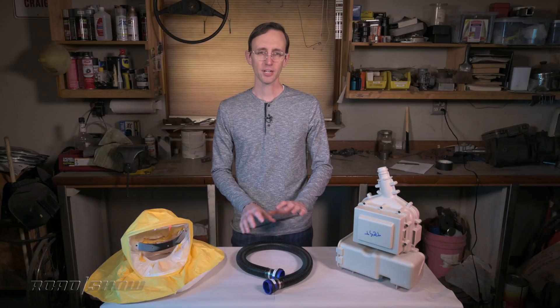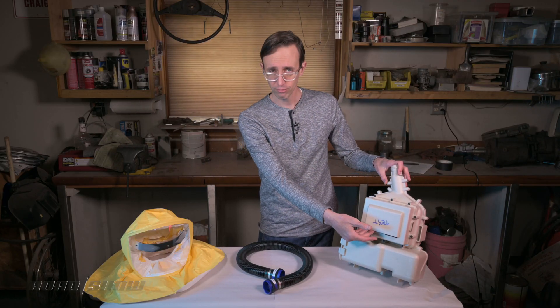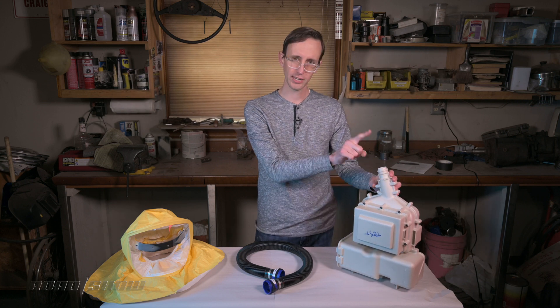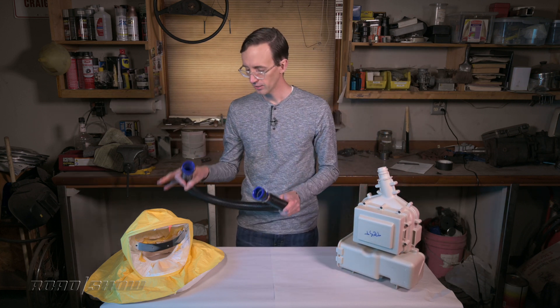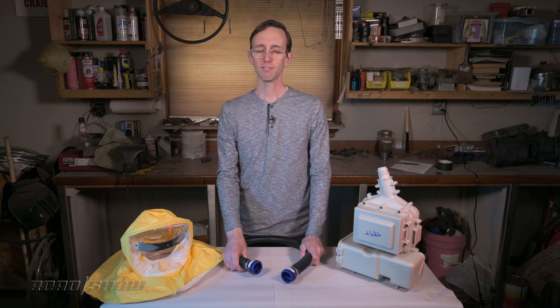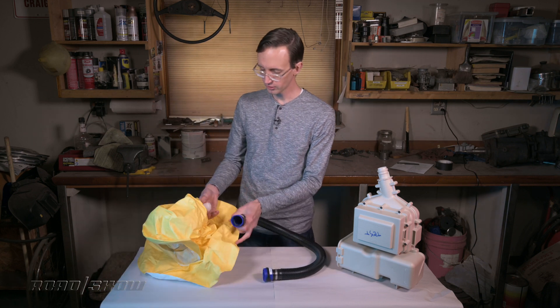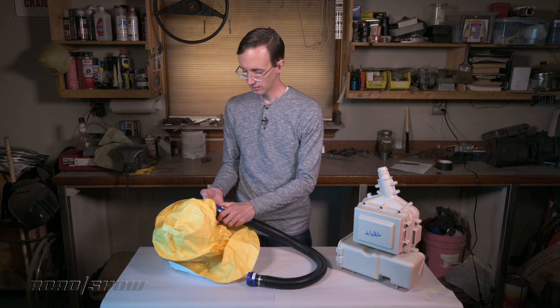As for functionality, it's all very straightforward. Air gets sucked in, it passes through that HEPA filter, the blower pushes it out of this nozzle, it runs through the hose, and then up into the hood, where it provides the wearer with an abundant stream of fresh filtered air. So this hose obviously just connects to the back of the hood like that.